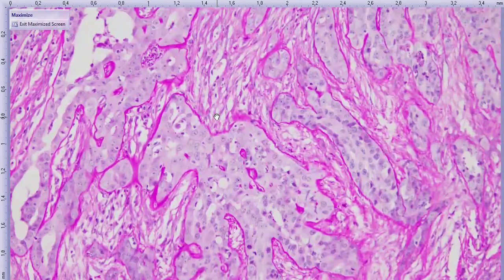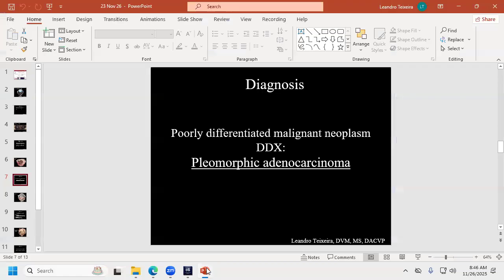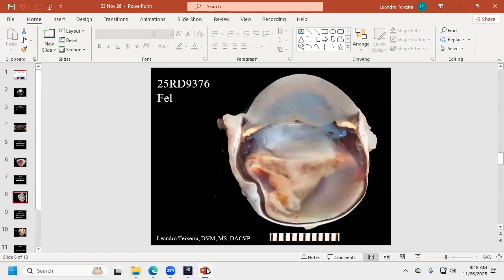I mean, it deserves that much time because we discussed this case a lot in the lab too, so I thought it would be a good one to bring over here to talk about. Yeah, Dr. Branco commented that they were running Melan-A on their sample because some have minimal basement membrane production with the PAS, and they were skeptical about the pleomorphic diagnosis. But it seems like this one has a ton of basement membrane production, so that goes along with it. Cool. Yeah, they're not as obviously epithelial as this one. Sometimes they can be very mesenchymal-like. Okay, next case.